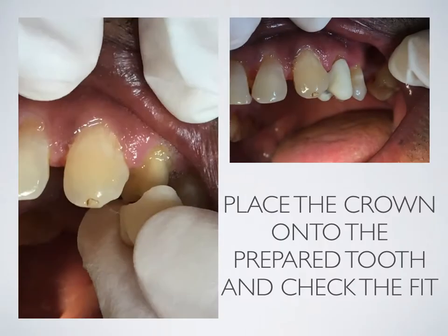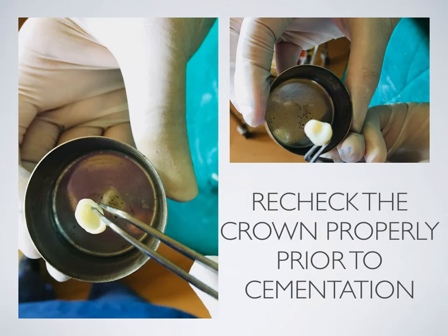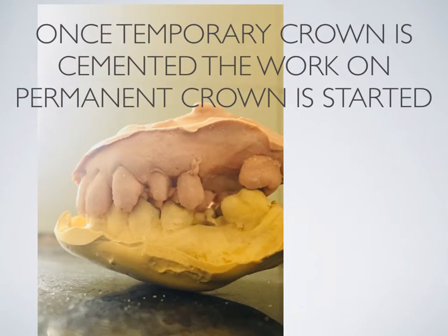Place the crown onto the prepared tooth and check for fit. Use articulating paper to check for high points, which reveals occlusal disturbances — cross-check with the patient's comfort accordingly. Recheck the crown properly prior to cementation. Remove excess temporary cement and inspect the crown thoroughly. Once the temporary crown is cemented, work on the permanent crown is started.